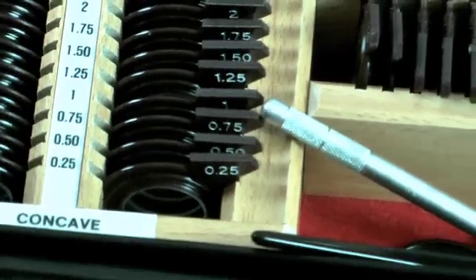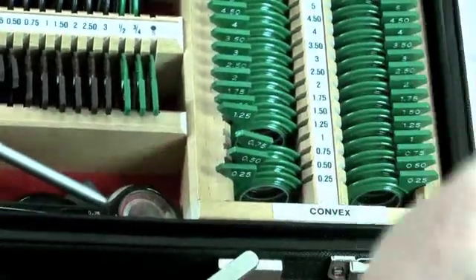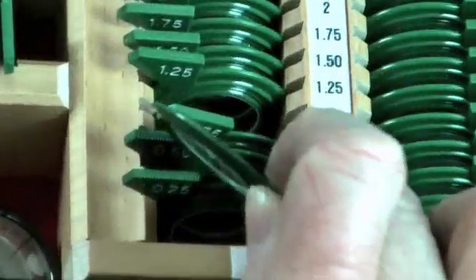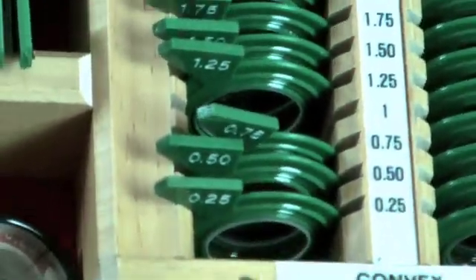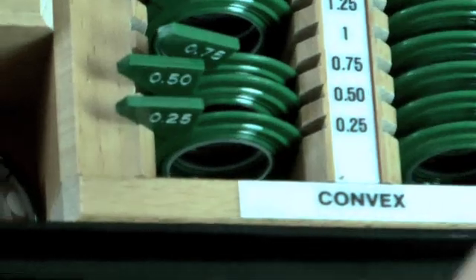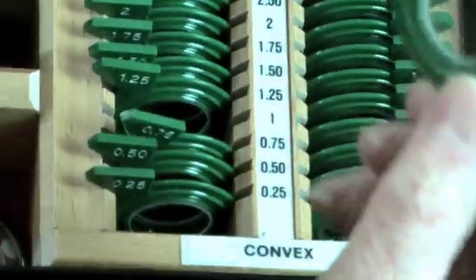Once we've done the pinhole test and we know that we can improve their vision with glasses, we then need to do the first step, which is to put that plus one lens into the trial frame. This is the number one, the convex lens here. So this is the plus one. Now the idea of this is to relax the accommodation. So we place the plus one into the trial frame.